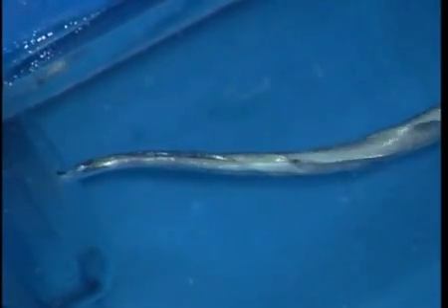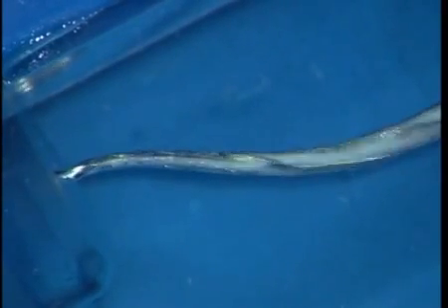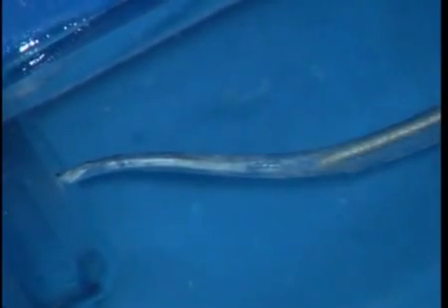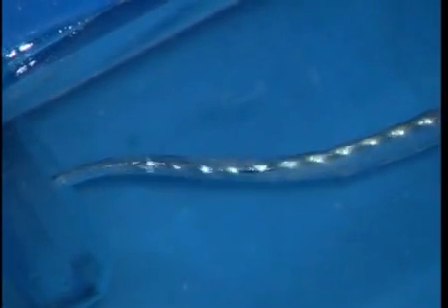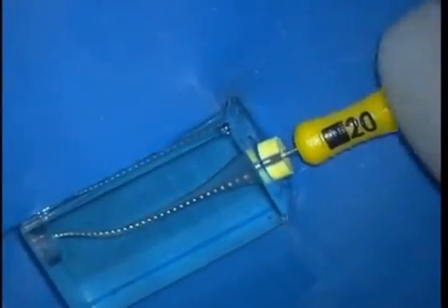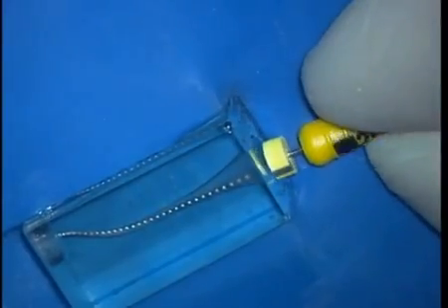Notice how the debris loads up on the instrument during the cutting action, whether we use a reciprocating handle motion or a balanced force technique. Irrigate, recapitulate, and re-irrigate to move debris out of the tooth. When the canal has been optimally cleaned, we want to gauge the foramen with a 20 hand file. By tapping on the handle gently, we can determine if the file is snug at length or loose at length.